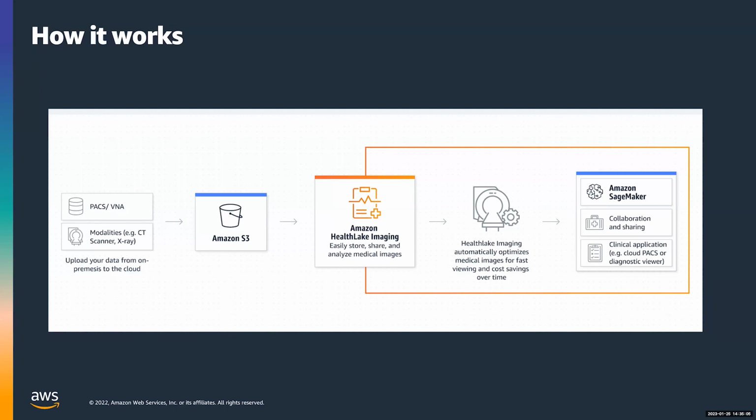It will take the pixels and whatever the compression type of the images in the DICOM data is, it will convert that into a file format called HTJ2K. So this is an alternative to JPEG 2000, which provides with the same compression ratio, but has the advantage of being way less consuming in terms of resources when it comes to the decoding of the images.